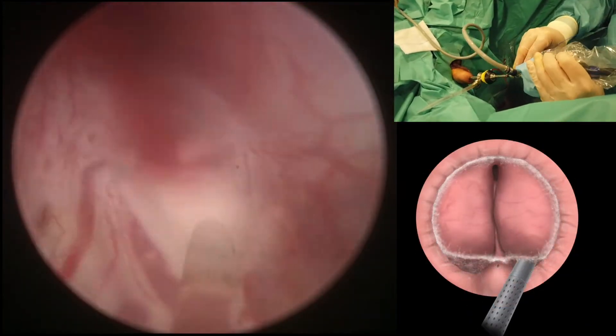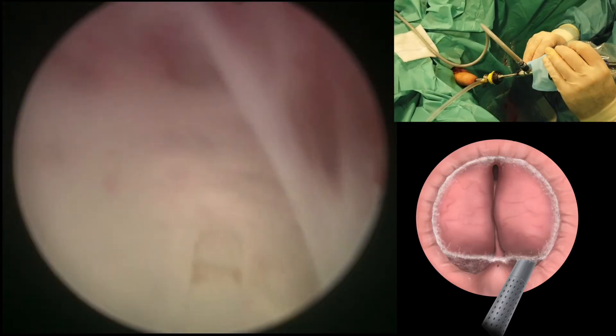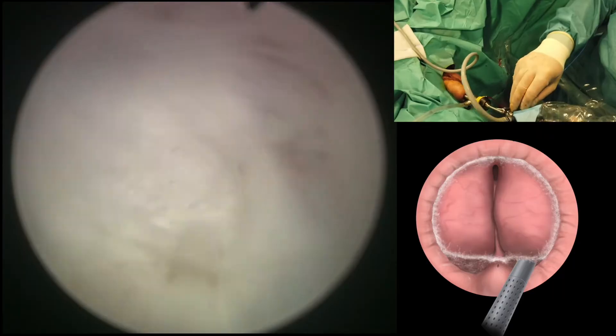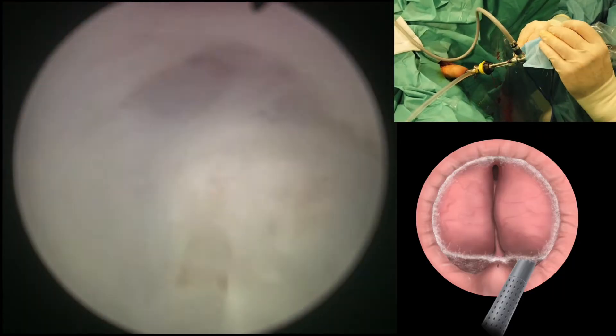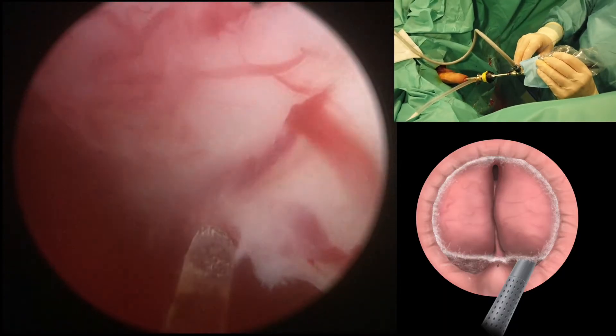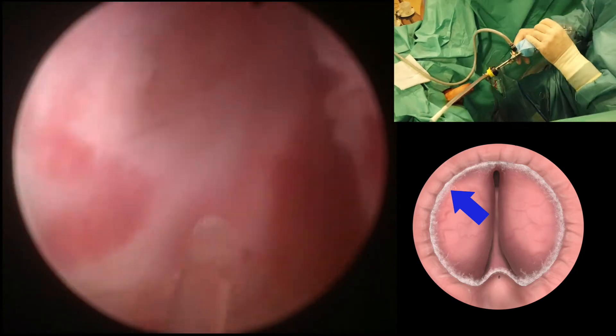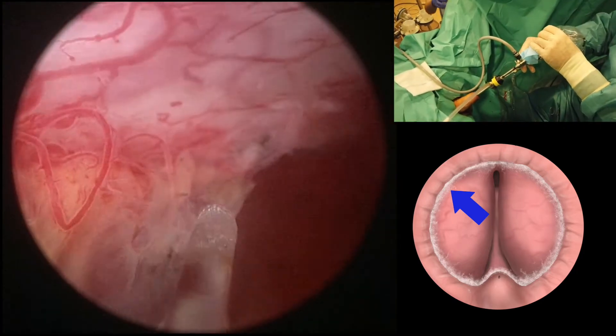Here again on the other side a similar maneuver is carried out, opening the plane between adenoma and capsule. And then of course we have to try to connect the 12 o'clock mark with the lower aspect carefully to preserve the sphincter's mucosa.